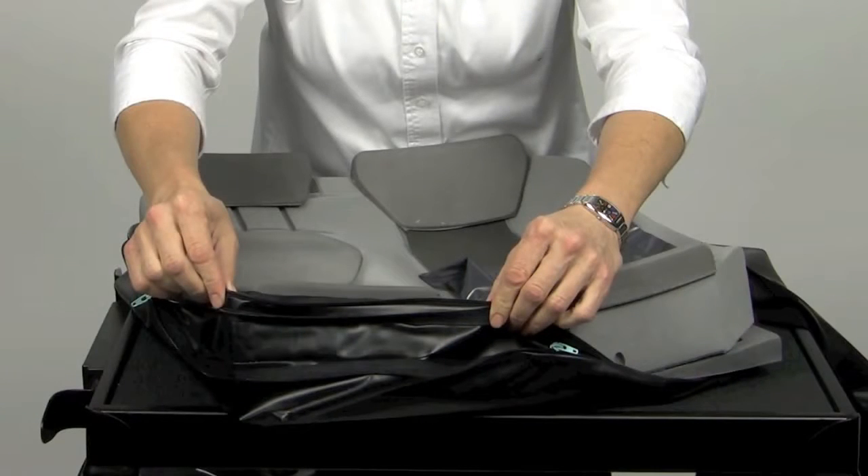The cover is also moisture resistant and breathable. The inner liner provides an additional layer of moisture protection.